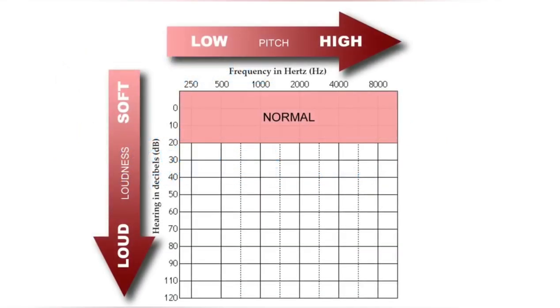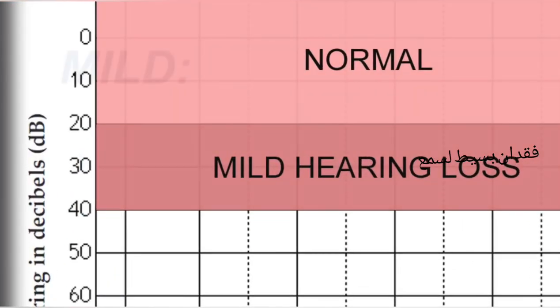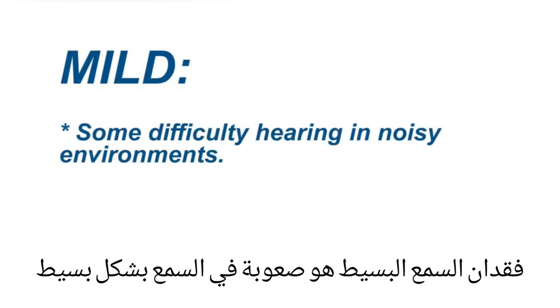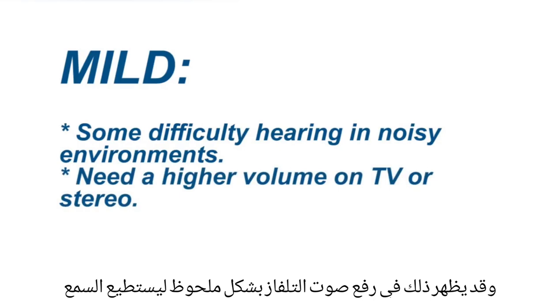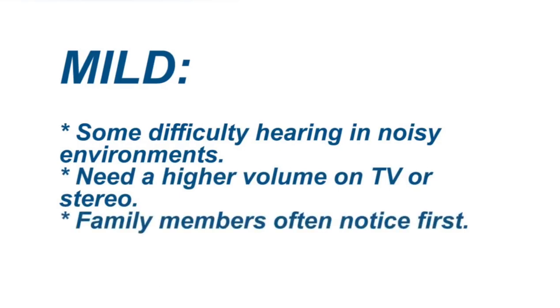If you have mild hearing loss, you will see the X or circle in the 20 to 40 decibel range. Mild hearing loss means you may be having difficulty understanding speech in noisy environments. It may also mean that you require a higher volume level when watching the television or listening to the stereo. Because of this, family members are often the first to notice.